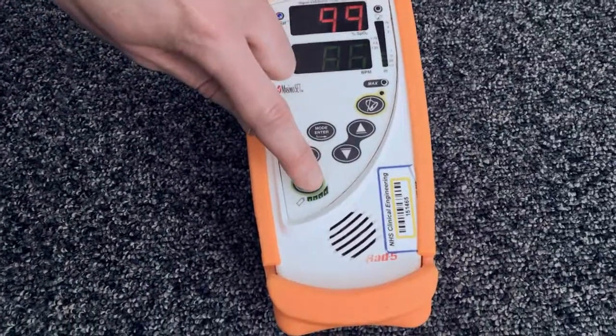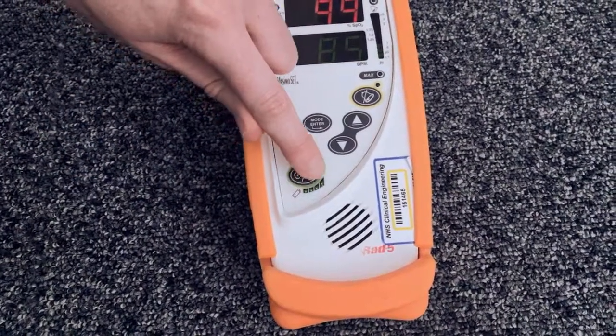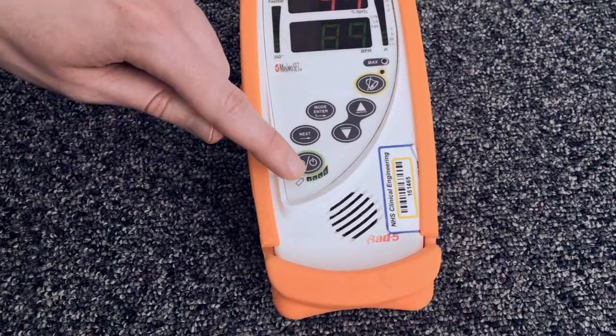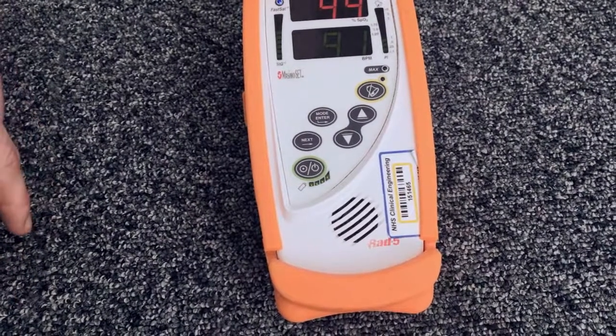Down at the bottom here is the battery indicator. There are new batteries in this monitor, so there are four bars displayed. When you get down to one bar, the monitor will alarm and it is necessary to change the batteries.